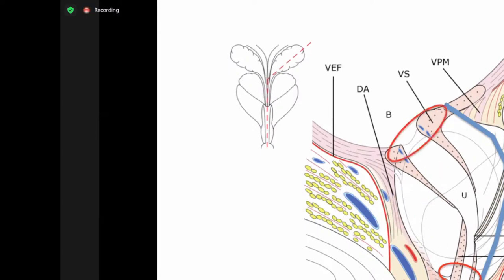But the other part, which is challenging, is actually the bladder neck, because when you develop the enucleation plane, you need an endpoint, and the endpoint is the bladder neck area. Once you get into the bladder neck, you know that's the endpoint. The problem is, especially when you go into the enucleation plane at the 6 o'clock position, sometimes you dig deeper and deeper, and you go kind of behind the bladder, and that can be very, very dangerous. So during the procedure, I think it's always safer to go to the bladder neck not at the 6 o'clock, but rather over the anterior part, either the 2 o'clock or 10 o'clock position. It's actually much safer. Once you get to the bladder neck, you know that's the endpoint. You can circumscribe the bladder area quite nicely.